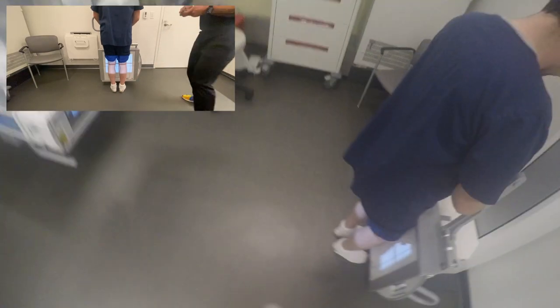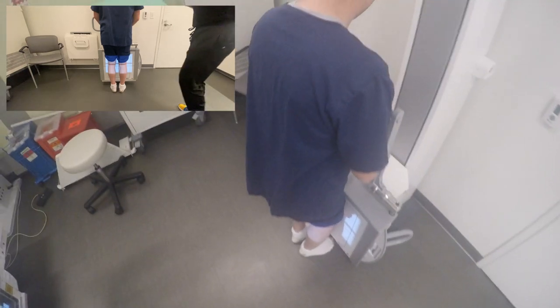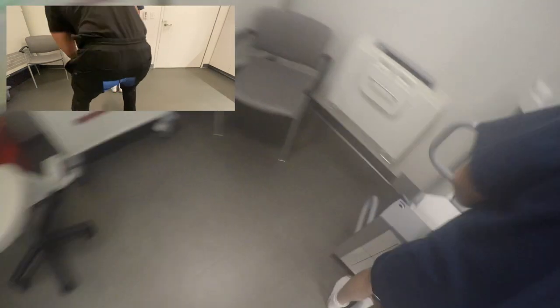It is very easy to miss-mark your PA and AP knees, so double and triple check your markers. Verify both knees are pointing forward. Collimate to the area of interest — and hurry up, as more times than not these weight-bearing views are for patients with possible osteoarthritis and they'll be very uncomfortable. The last thing you want your patient to do in any view is the most uncomfortable one for them. Also don't forget to label them with weight-bearing, or WB.